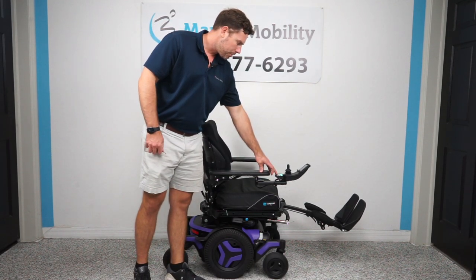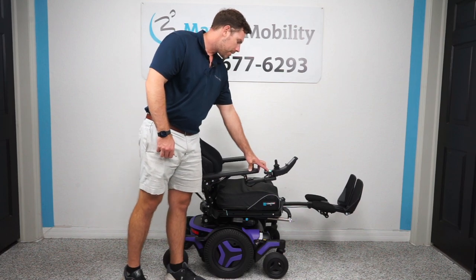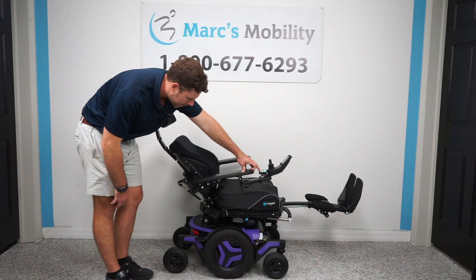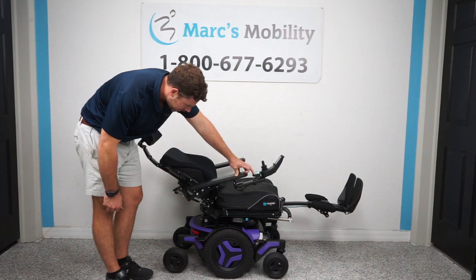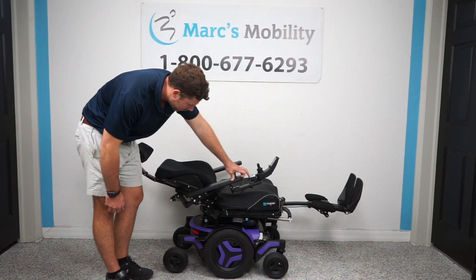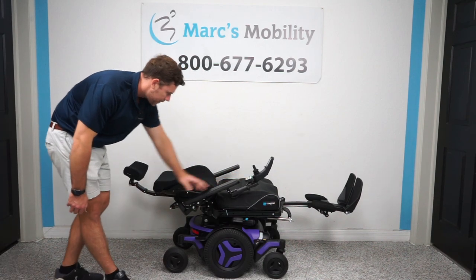The next feature is electric recline. I already showed you the electric legs going up and down. For the recline — if you want to lay back — this chair can go back to a 180-degree recline, which is basically flat. If your chair does not do that, it is programmable for all Permobils to get to 180-degree lay flat. This is really for if you need to transfer or need to sleep in the chair. This is what the full recline looks like at 180 degrees — a very comfortable chair.